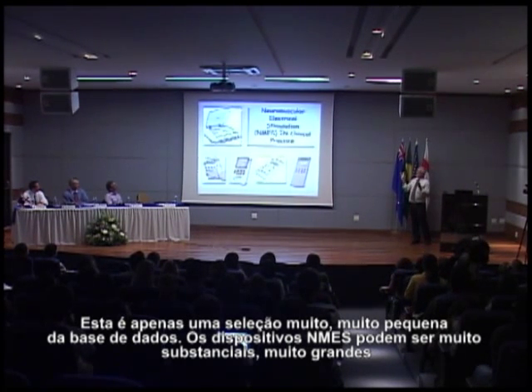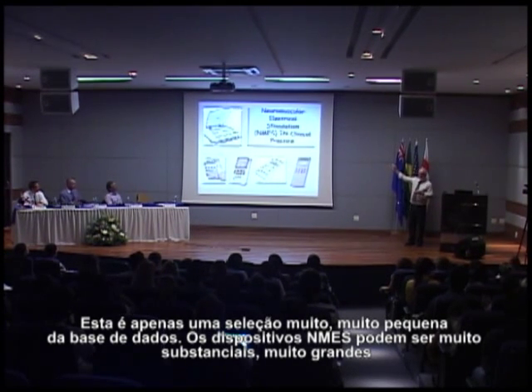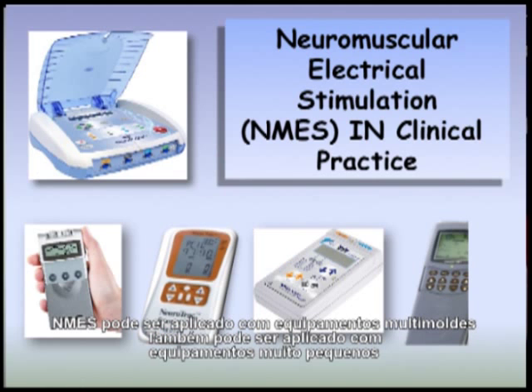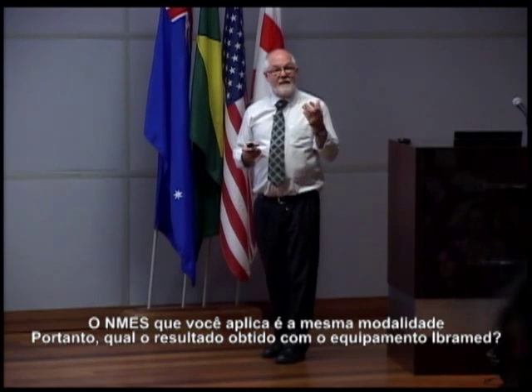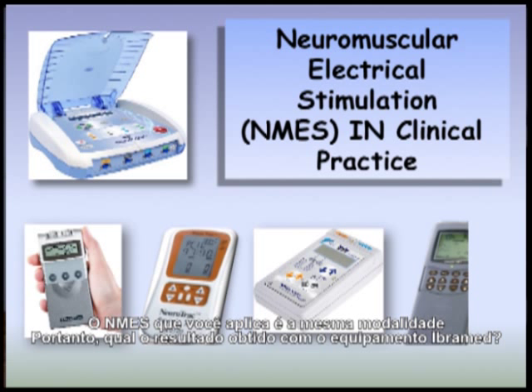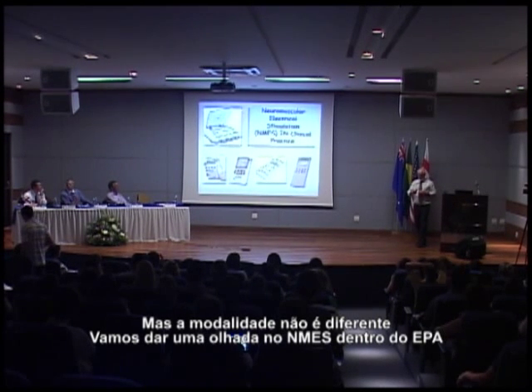Okay, so NMES devices can be very substantial, can be very big. NMES can be delivered from multi-mode machines, and NMES can be delivered from very small machines. The NMES you deliver is the same modality. So what comes out from the big machine, the IBRAMED machine, the NMES from here is the same as the NMES from all these other devices. The modality is no different.